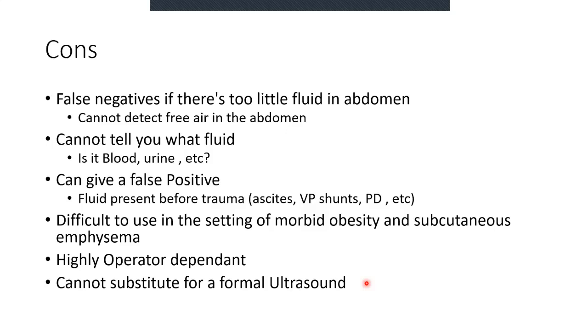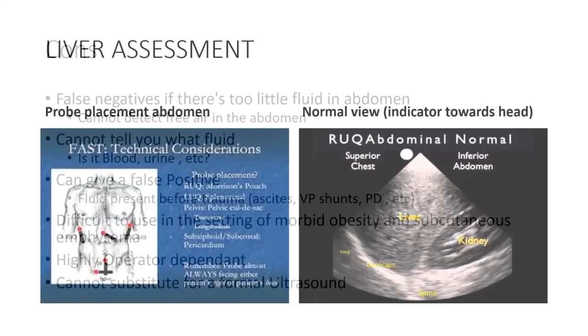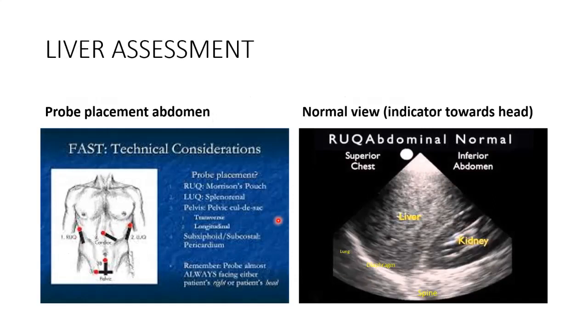Not only that, their spatial anatomical knowledge is far beyond anything that we know. So please don't try and compete with them. You will lose. So, the liver assessment. Where do you place the probe?